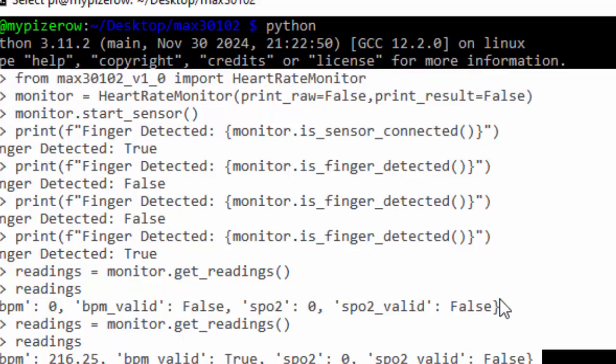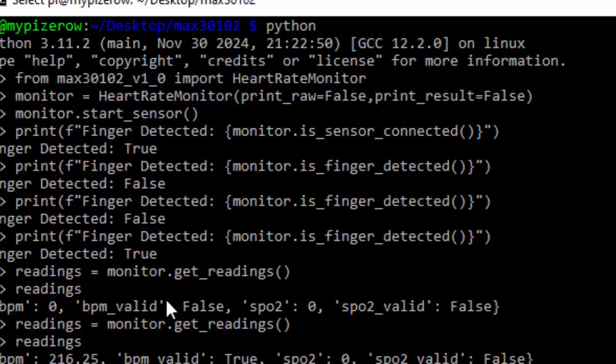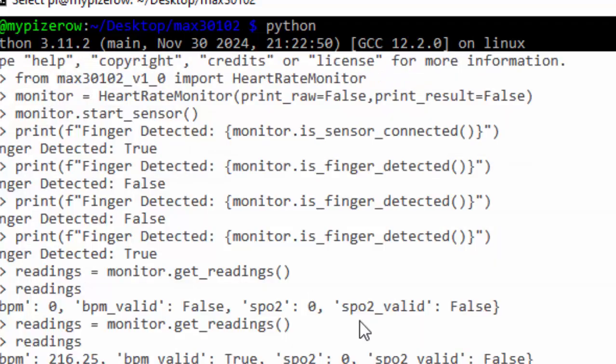So that's how you read the pulse oximeter sensor in a Raspberry Pi Zero.